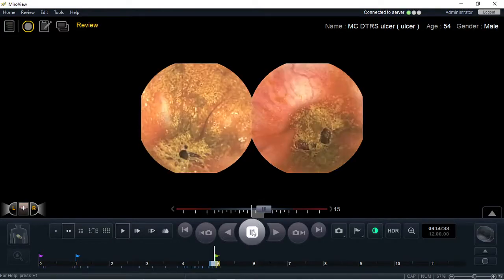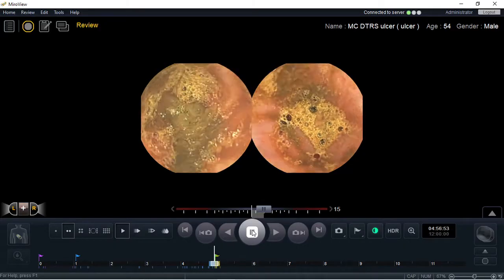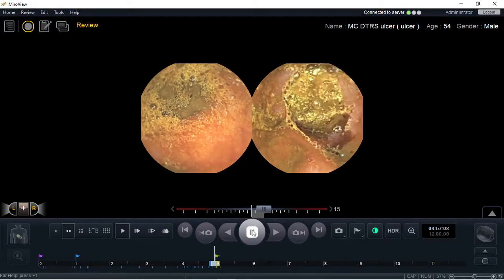Hi, this is another demonstration on why the double-headed capsule is better than a single-headed capsule using the Intramedic MyroCam system.